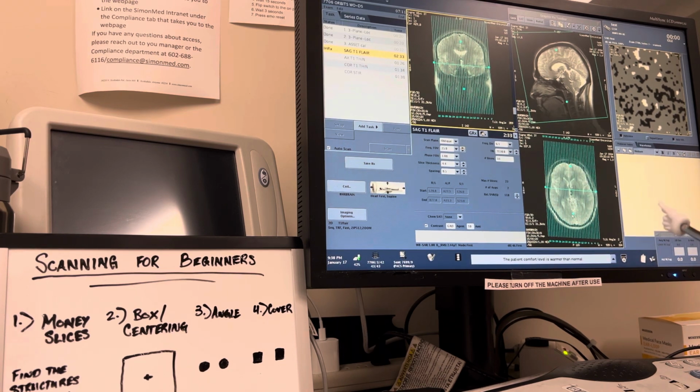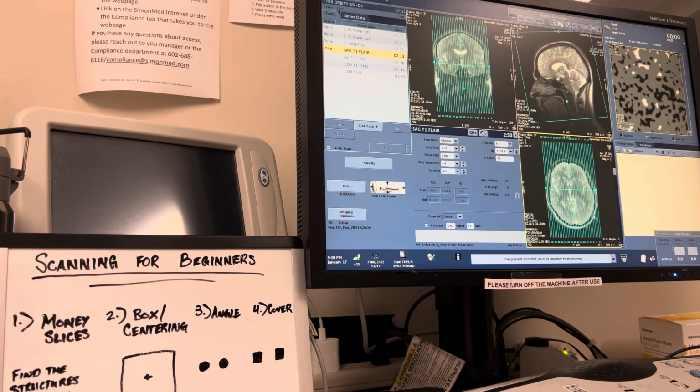And remember, if you grab that dot and drag away, it's a lot less sensitive when you angle it. So why don't you grab that and drag down, drag all the way down. There you go. So now try angling it, and it's a lot less sensitive. Keep going. Right there. Let's check that out. Let's go a little bit more. There you go. Okay, so this looks good.